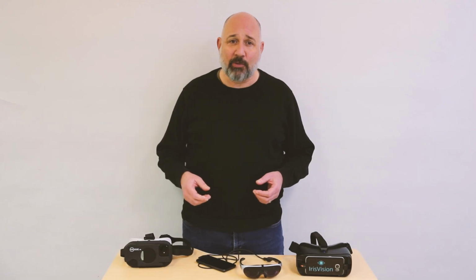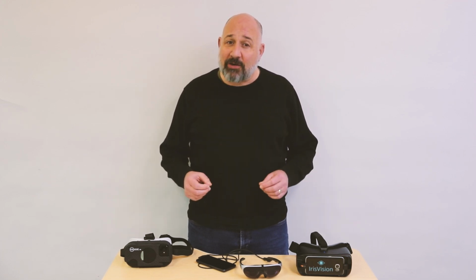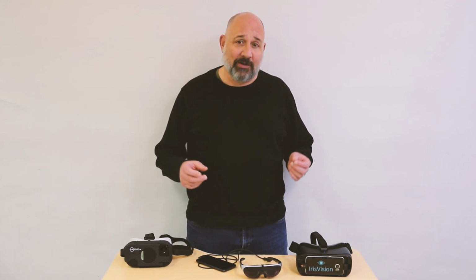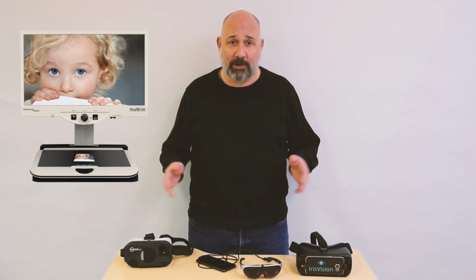So despite all the marketing materials that manufacturers put out stating that this is a solution for macular degeneration, I've rarely found them to work well for that audience. I've had many people use our loan program to try head-worn aids and report that they put on the headset and they couldn't see anything. What works better for the macular degeneration crowd is a video magnifier with a large screen where they could put their peripheral vision to work.